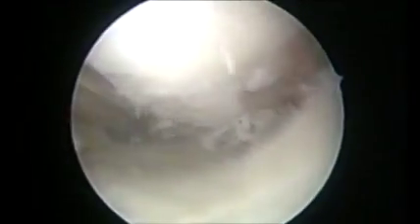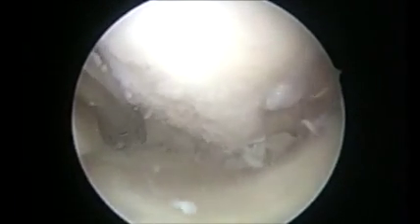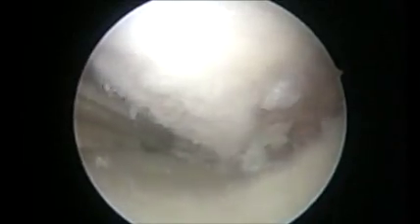Partial medial meniscectomy has been done, and chondral flaps have been trimmed using a motorized shaver.